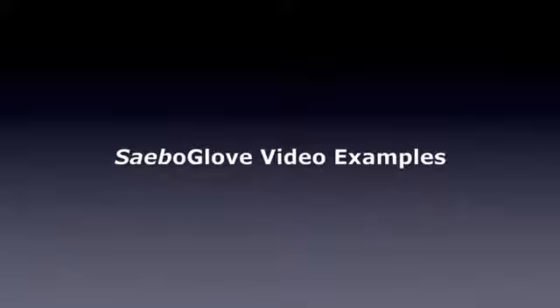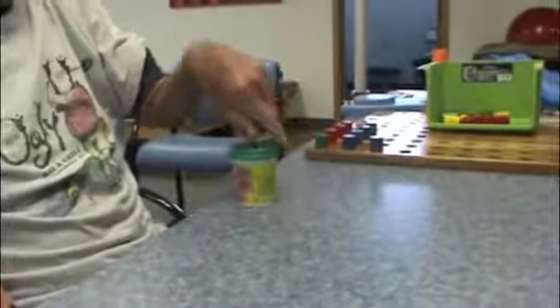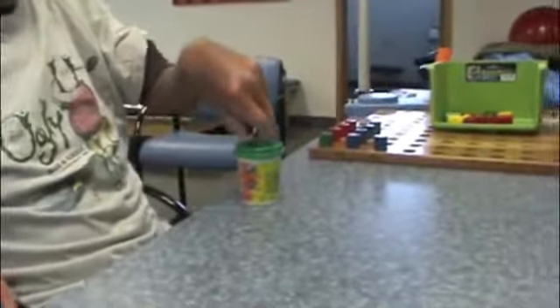Here are some video examples of clients using their affected hand with and without the SABO Glove. In this first example, the client is unable to grasp the container due to limited wrist and thumb extension.